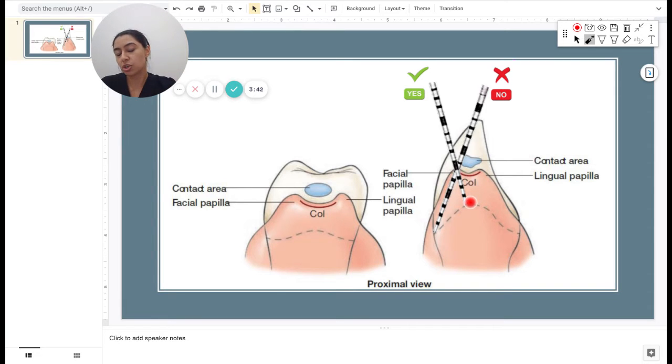You want to make sure you measure the CEJ accurately too. So when you go in here, you're measuring the CEJ, you're feeling for that CEJ, and then you're going up to measure the free gingival margin in comparison to the CEJ. If the free gingival margin lies above the CEJ, then you are going to get a plus number. So in this case, it's a +4. And also, since the base of the pocket is right at the CEJ, it's going to be a +4 for your probing depth too. So it is the same number for both measurements.